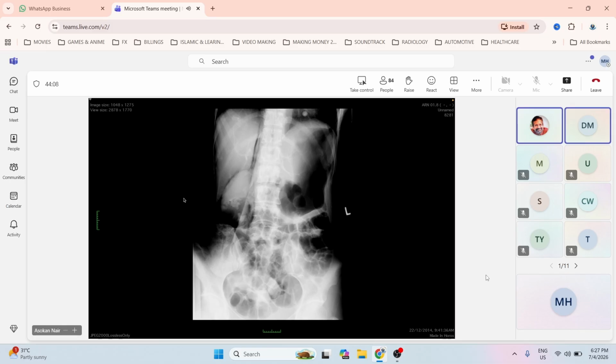Now you can tie the two together. How did you get air in the retroperitoneum? Second part of the duodenum perforation, likely secondary to the ERCP. Yes, and when does it happen? When they do the endoscopy and go to the second part, how do they perforate usually?